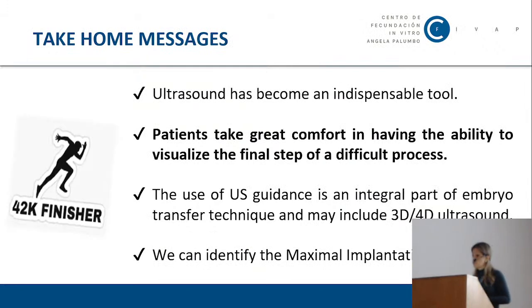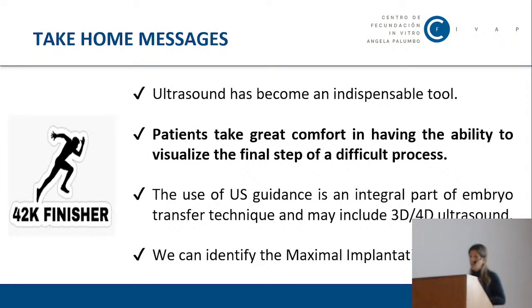The messages that we want you to take home, in addition to the learning objectives, are: ultrasound has become an indispensable tool to monitor, guide, and verify our embryo transfer procedures. And importantly, patients feel comfortable having the ability to visualize the final step of a difficult process.